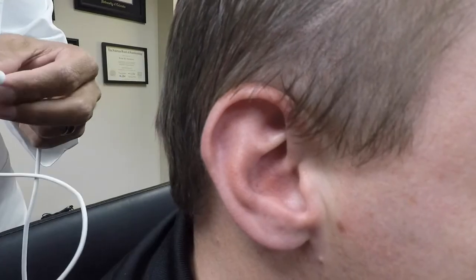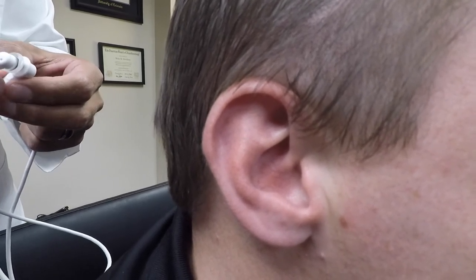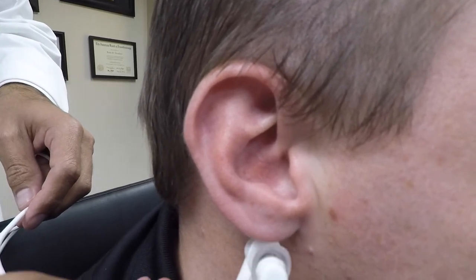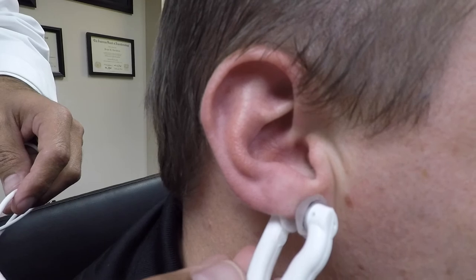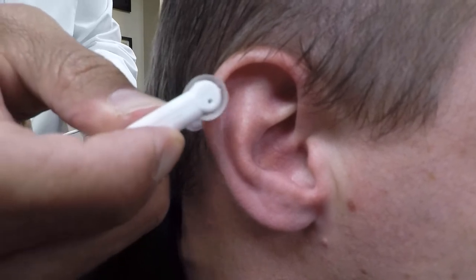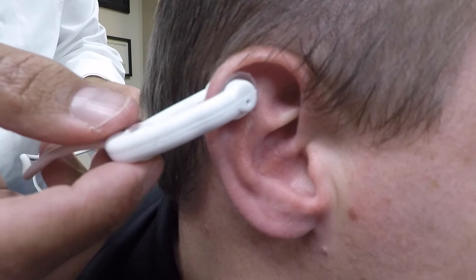I'll show you how to properly use the ear probe, which is commonly used in the operating room, intensive care unit, emergency department, and many other areas of the organization. Before I show you the proper way to utilize the ear probe, I'll show you the improper way, which is commonly how a lot of people use it. People will typically apply the ear probe to the lobe of the ear — that is not correct. Or they'll apply the probe to the outer part of the ear — that is also not correct.